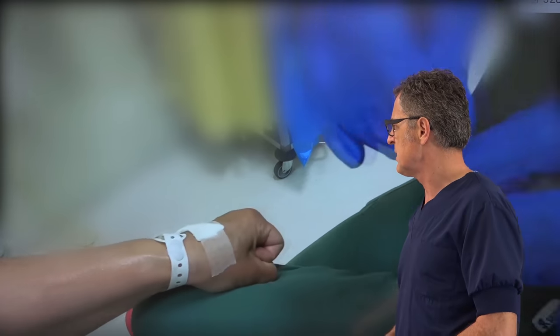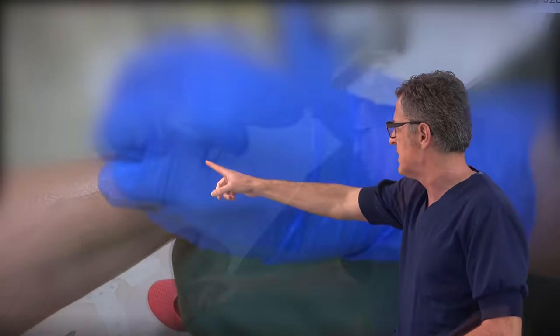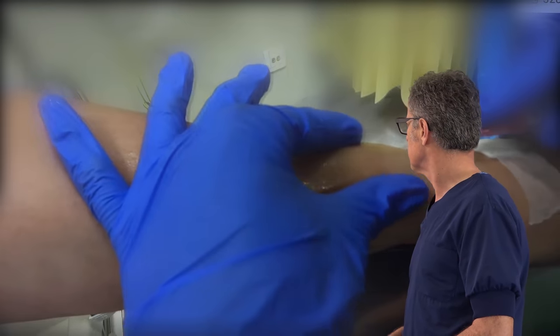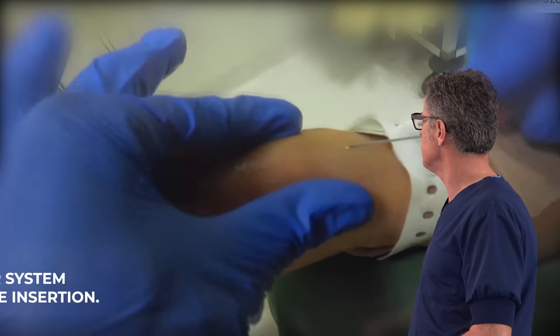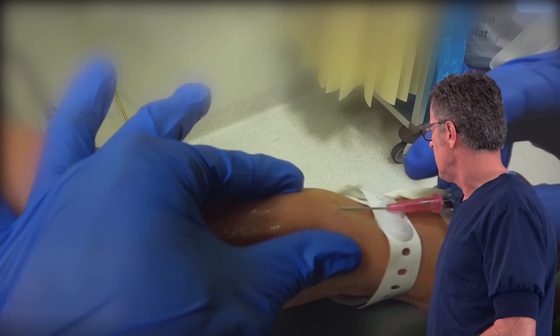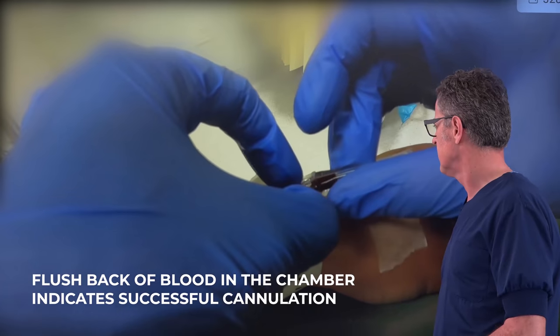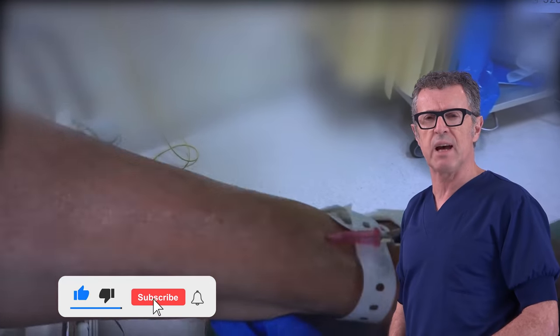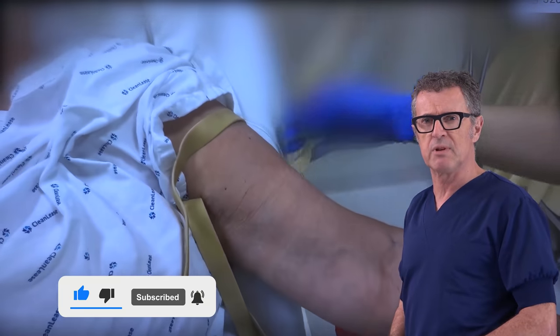Here we are going to use a 20-gauge catheter for this vein. We can see how prominent the vein is. We stabilize the vein, the needle enters the lumen, we get a quick flashback — and voilà. Successful placement of the IV catheter using the triple tourniquet technique.